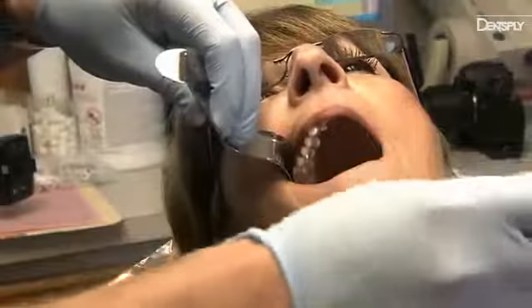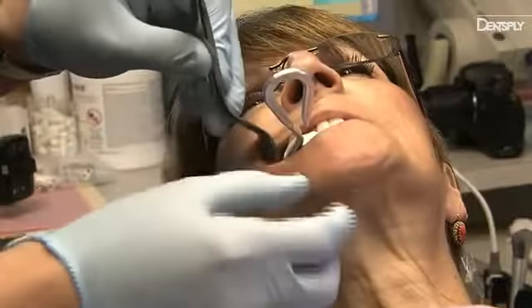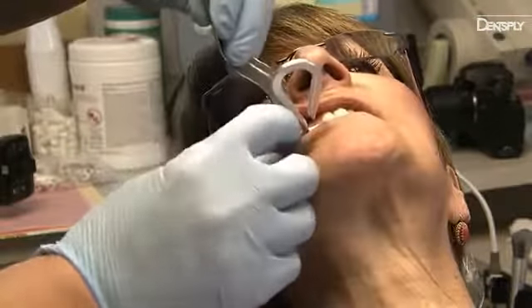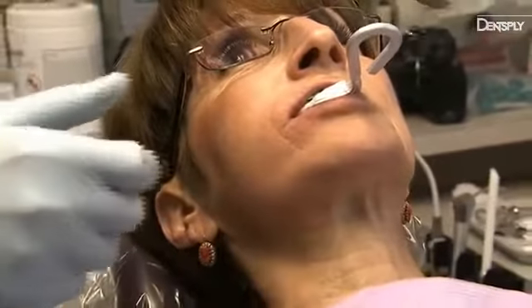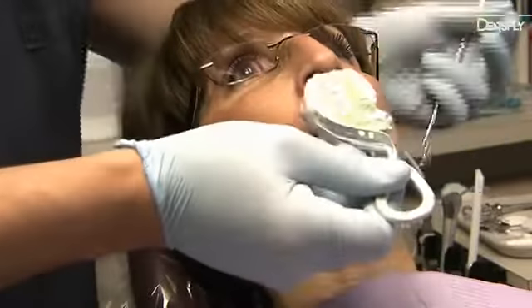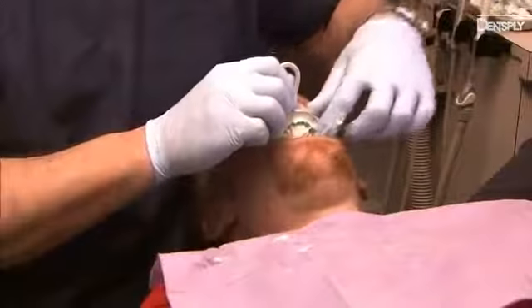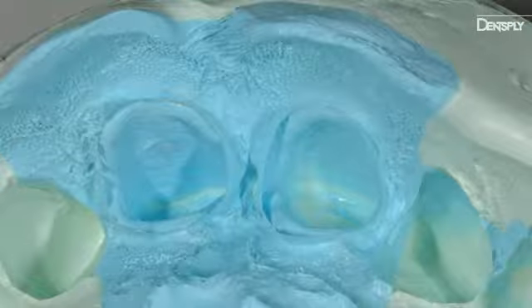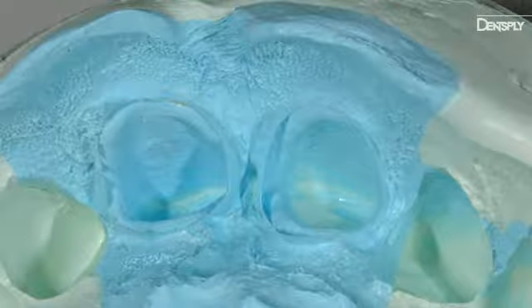Place the Aquasil Ultimate Tray Impression Material into the mouth no later than 35 seconds from the start of syringing for a single unit, or one minute from the start of syringing for a multi-unit. Both cartridge fill levels are designed to be fully expressed within this timing to ensure work time is not exceeded. Remove the tray after 3 minutes for a single unit, or 4 minutes and 30 seconds for a multi-unit. Enjoy a perfect impression every time without the use of cord or retraction paste.